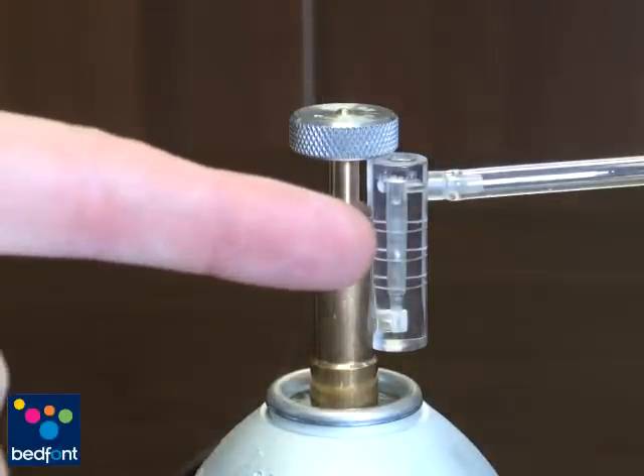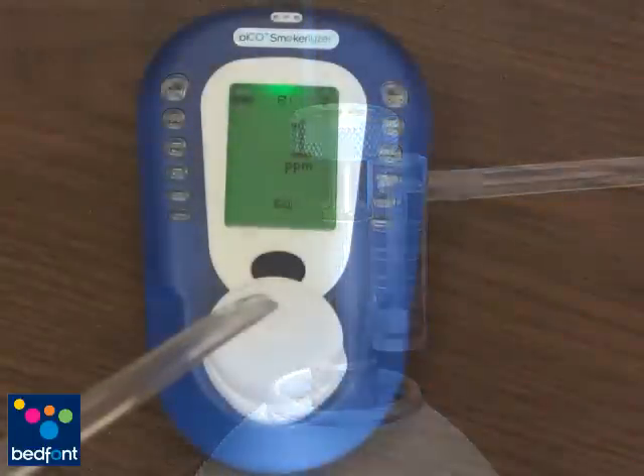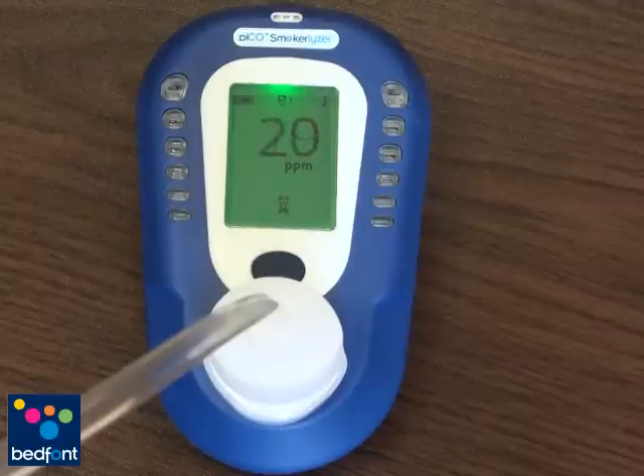Allow the gas to flow through the instrument for approximately 1.5 minutes. Remember to keep a close eye on the flow rate and adjust accordingly. You will notice the values climbing on the display of the monitor. Once the value has ceased to increase or 1.5 minutes has been reached, the final measured value will be shown and sampling will cease.